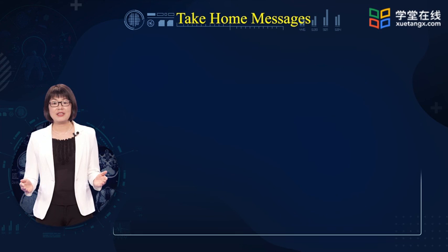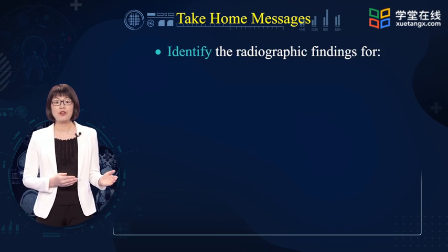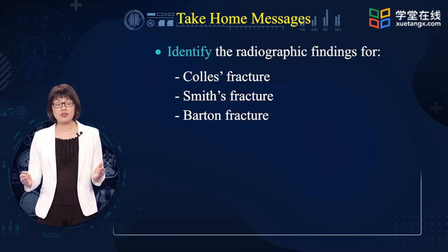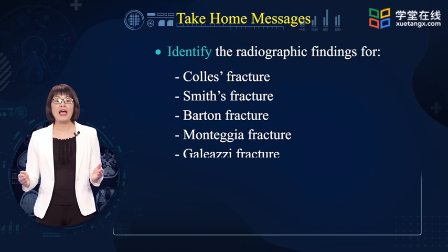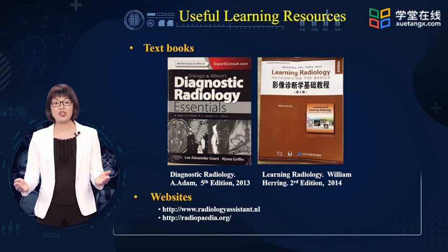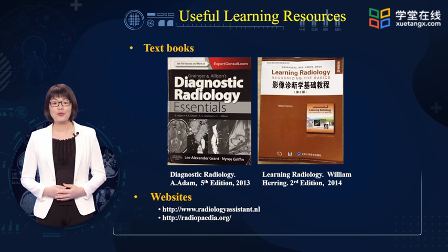Here are the take-home messages. I hope you are now able to recognize the radiography findings for these following fractures: Colles fracture, Smith fracture, Barton fracture, Monteggia fracture, Galeazzi fracture, and greenstick fracture. That's all for this session, and these are useful learning resources for you. Thank you for your attention.